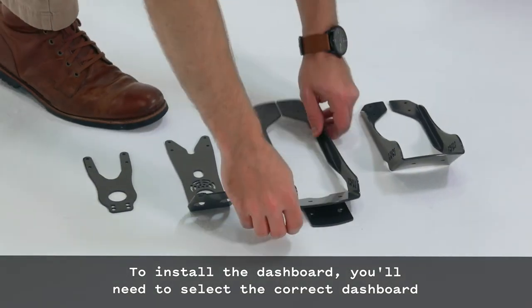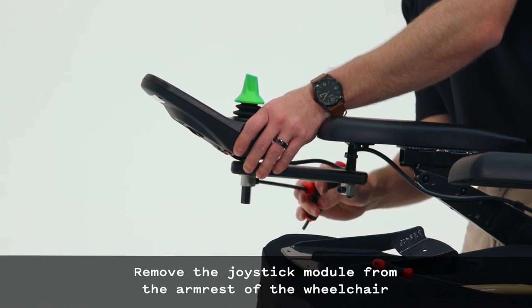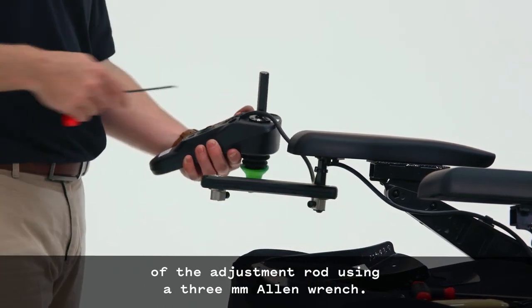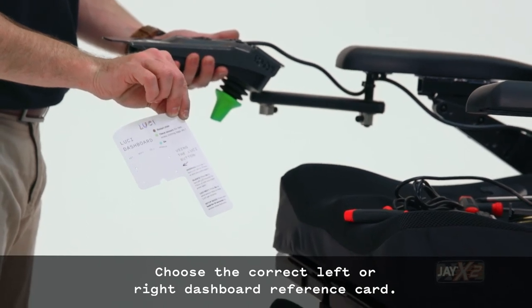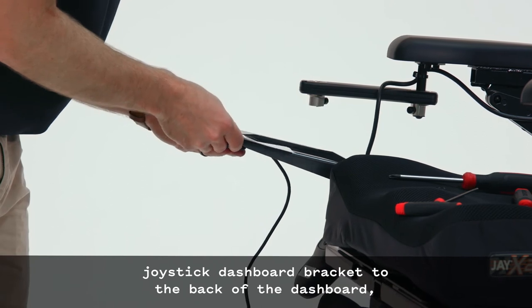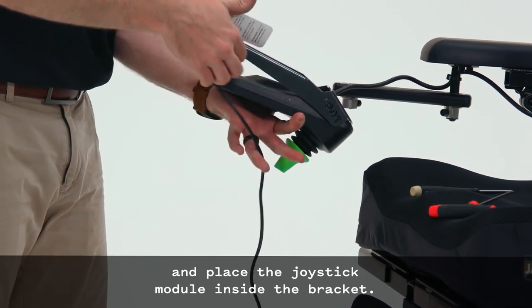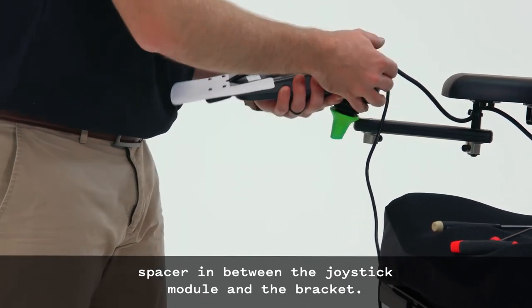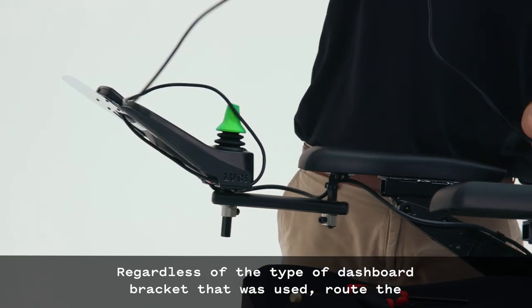To install the dashboard on a color joystick, remove the joystick module from the armrest using a 5mm Allen wrench. Remove the two screws on the bottom of the joystick on either side of the adjustment rod using a 3mm Allen wrench. Feed the joystick cable through the split in the color joystick bracket. Choose the correct left or right dashboard reference card. Use four 4-40 x 3/16-inch screws to attach the color joystick dashboard bracket to the back of the dashboard with the reference card behind the bracket. Route the dashboard cable along the lower inside bend of the bracket and place the joystick module inside. Turn the joystick module upside down and slide the color joystick spacer between the joystick module and the bracket. Insert two M5 x 16mm hex head screws and tighten with a 3mm Allen wrench.